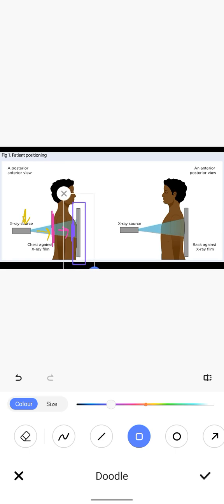This is the detector. As I have shown you in the previous video, you can say this is a detector or the cassette, which is getting the information from the patient.